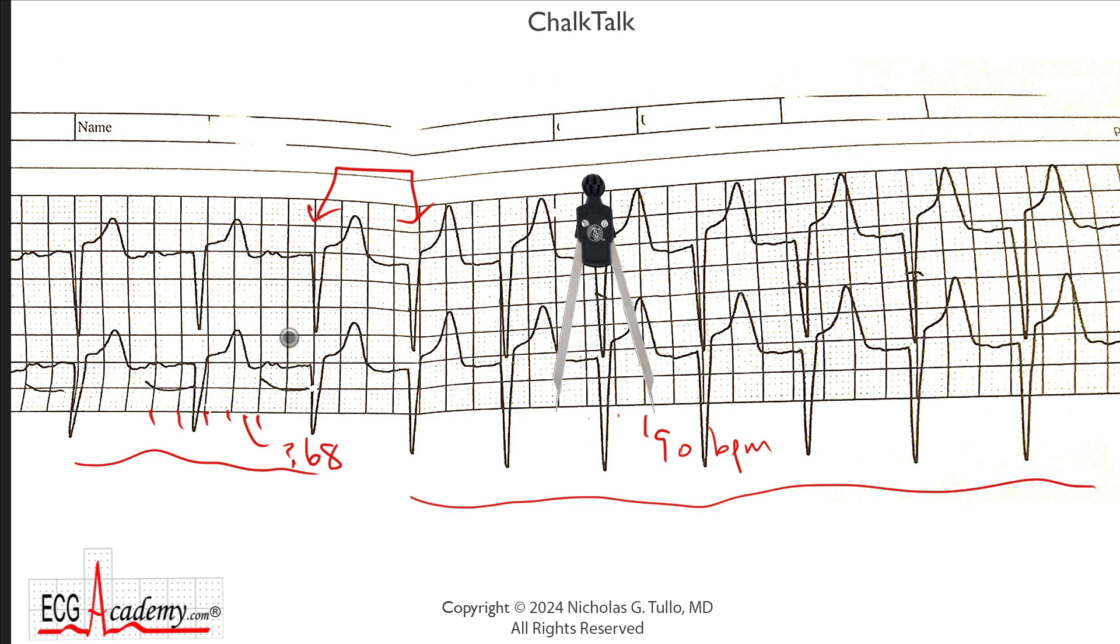When you start looking at the details, these first three QRS complexes have a pretty clear P wave in front of them. And the other thing is that the PR interval is really quite long. This PR is measuring almost 400 milliseconds, two large boxes. Let's zoom in and make it a bit easier on us.